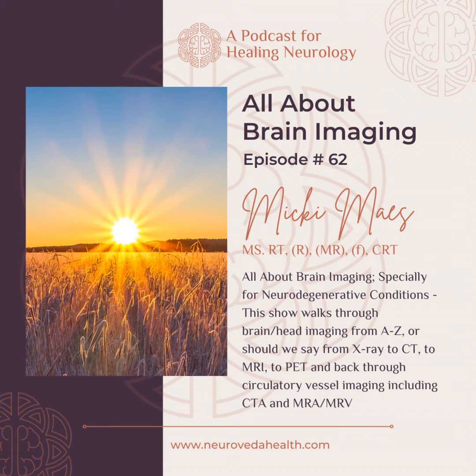In general Alzheimer's disease, we're going to see a gradual pathologic progression in most instances. And from the brain's perspective, specifically on MRI, we're going to see global atrophy, especially in the medial temporal lobe, which will include the hippocampi, parahippocampal gyrus and entorhinal cortex.